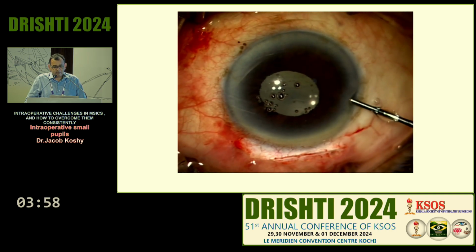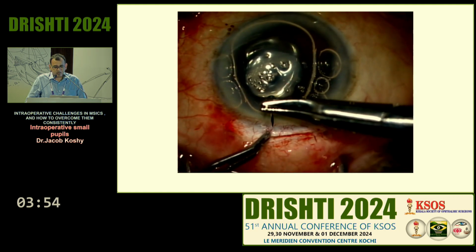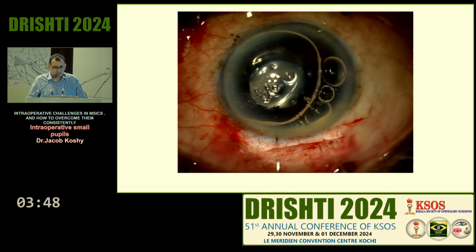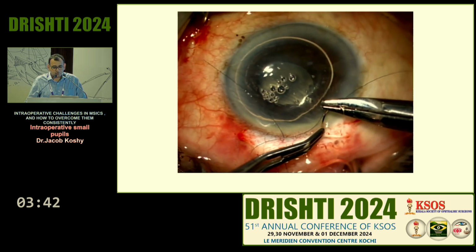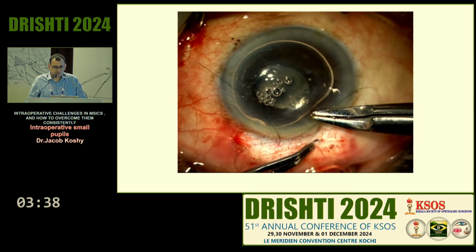Cleaning it up. Any patient you've done a vitrectomy, please remember to put in a suture. The last thing you want after all this is to try and go back because you have a leaky wound or a soft eye the first post-op day. So generally what I would do is I put a single cross suture for these cases.